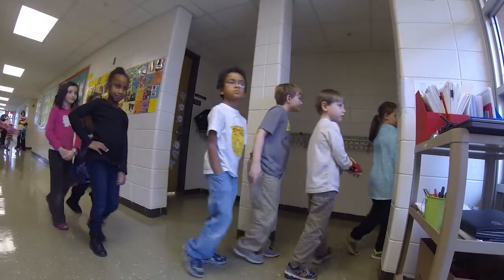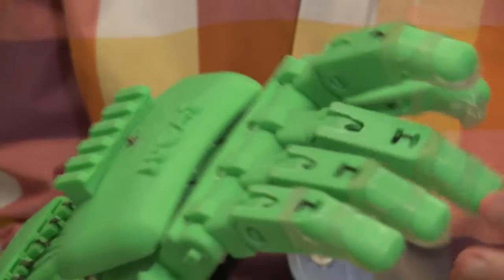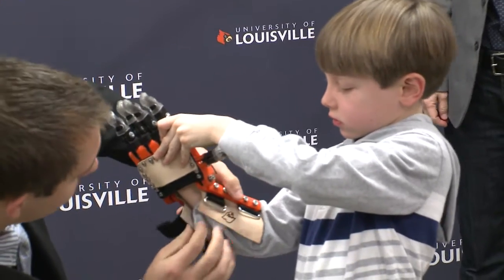We had known about Robohands for a couple years, trying to find access to someone that could build something for him — that had access to 3D printing and that kind of technology, which was kind of out of our reach. There is a website called Enable, and the goal of Enable is to identify makers, designers, individuals that have expertise with 3D printers, and match them with children that have a need for a prosthetic hand.